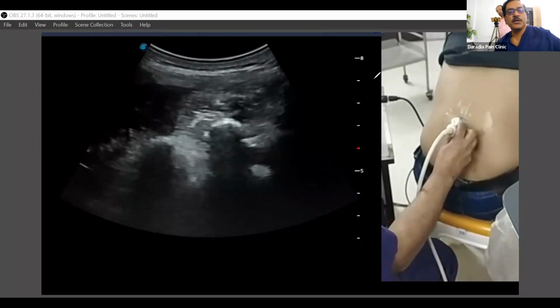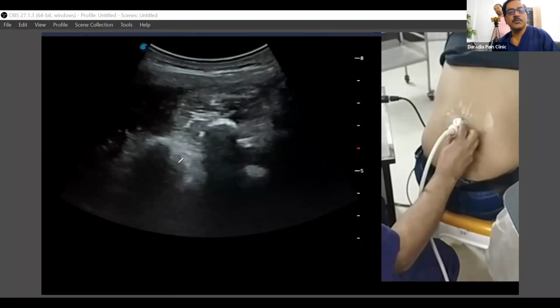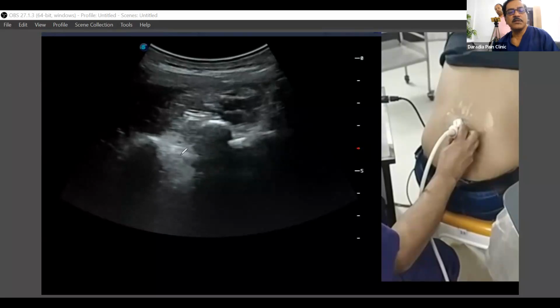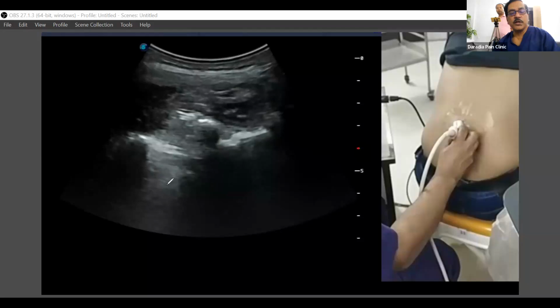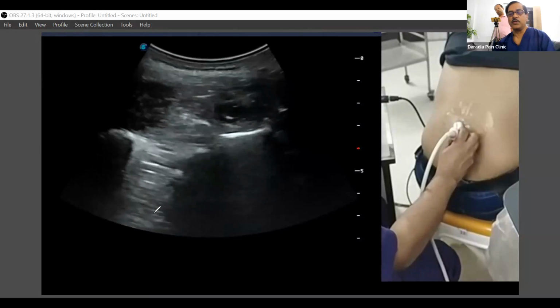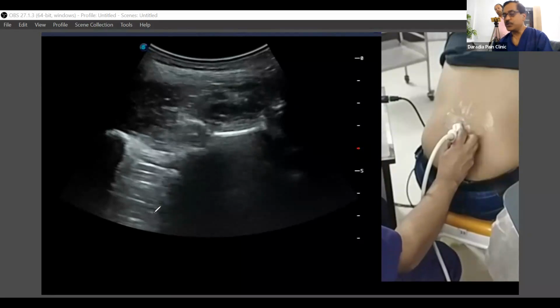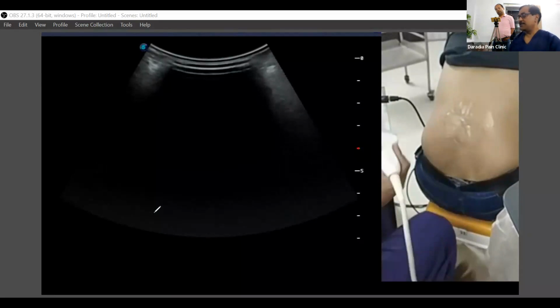You can see the nerve root there, and also see the pulsating blood vessels there. These are blood vessels anterior to the nerve root. See here, this one, and also some blood vessels in the lower part of the foramen as well. So in the foramen, remember, lots of blood vessels are there, and this is your nerve root. This is how you can see the foramen, and the ultrasound beam is going down through the disc, because the lower part of the foramen, if you are putting a needle, it will go into the disc. So this was the sagittal scanning.